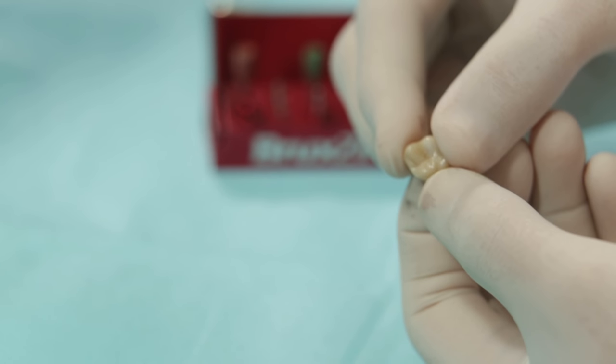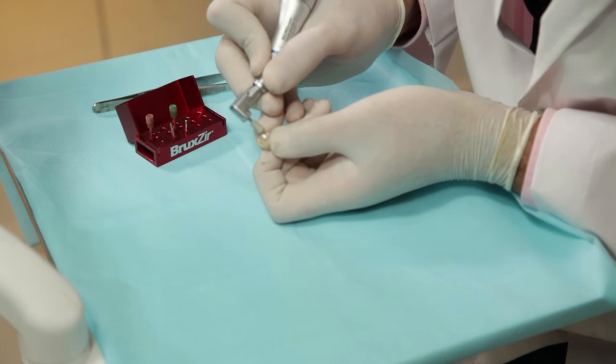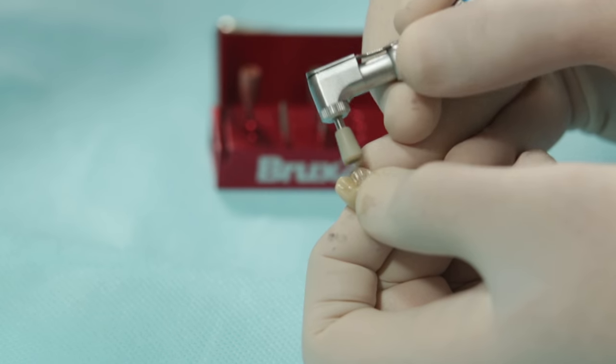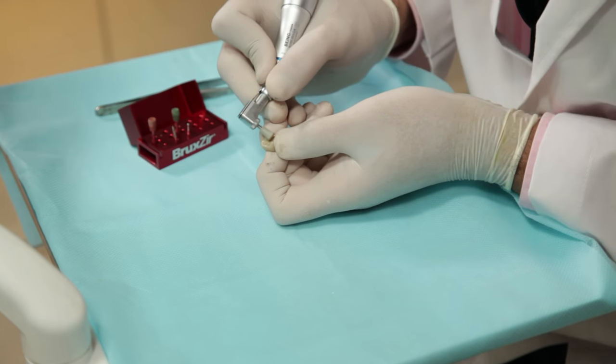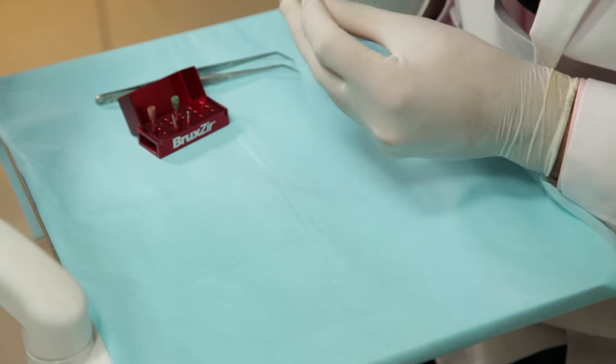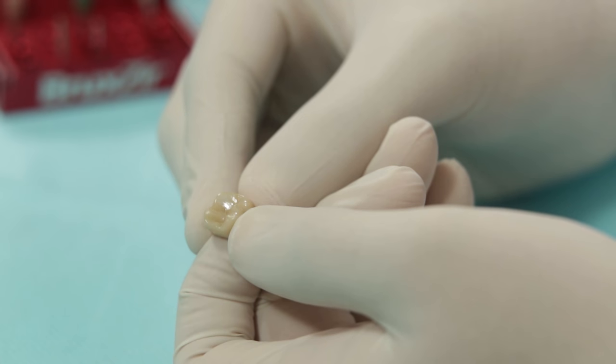The next step is to use the white cup. This has the finest grit of diamonds. This is what the crown looks like at the end of it all. You can see how smooth the surface has become — almost like a mirror surface.